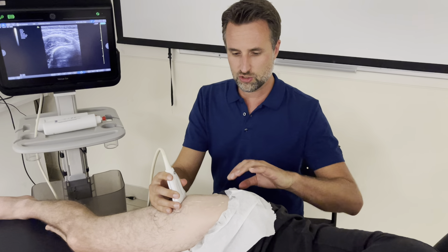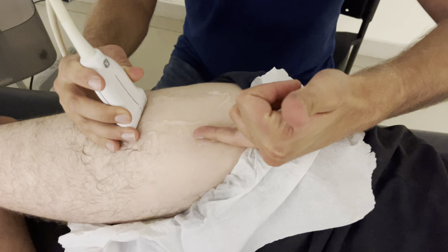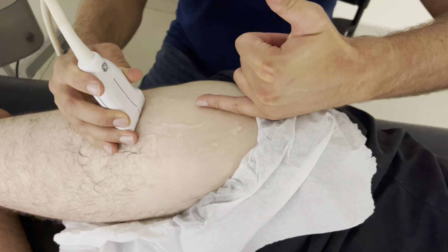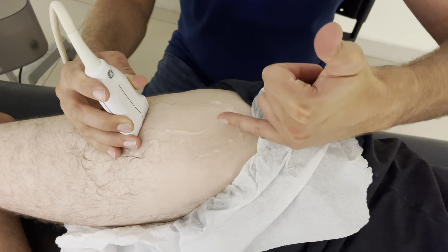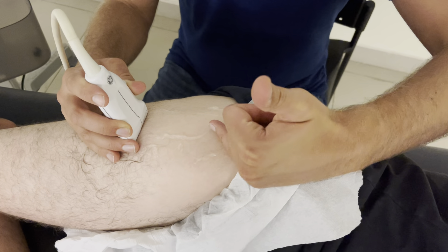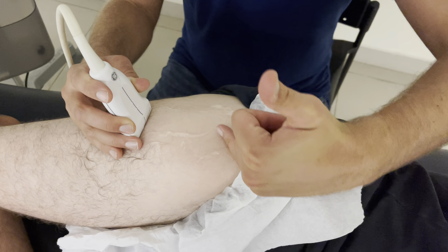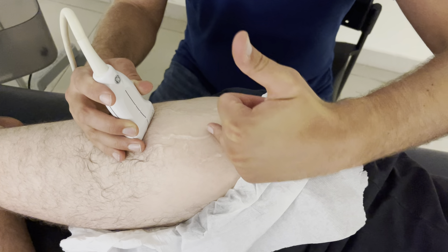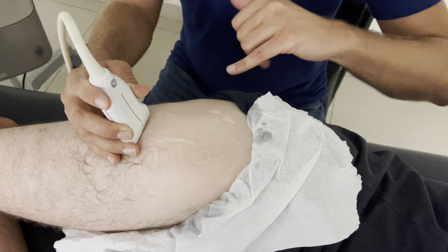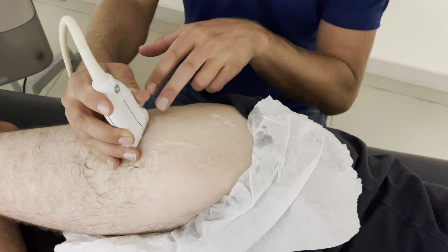For the gluteus medius insertion, here was the minimus. The medius is a bit more dorsal and the angulation of the fibers are a bit more angulated than the ones of the minimus. So this is more or less the angle that the fibers will attach onto the lateral facet right here. And we're going to take a look first in short axis and then in long axis.